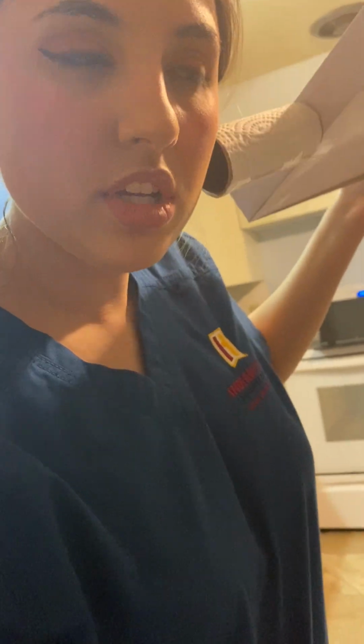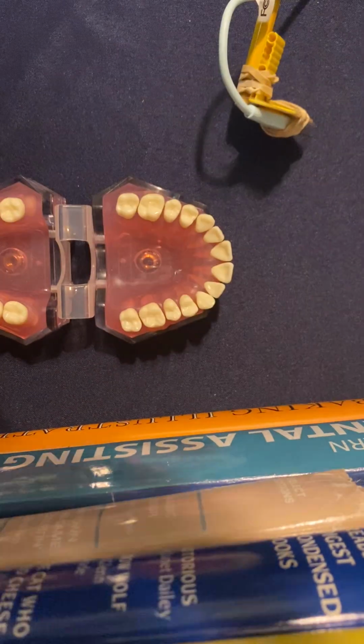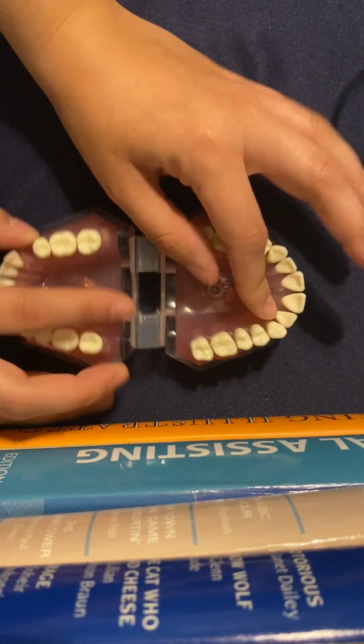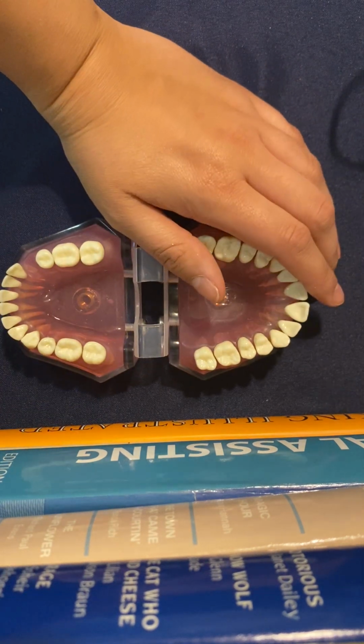When they say outer eye, they mean from this eye. You want to be flat with the cheek when you're doing those, because when you don't, you get a really bad cone cut, which I used to get quite a bit before I figured that out.